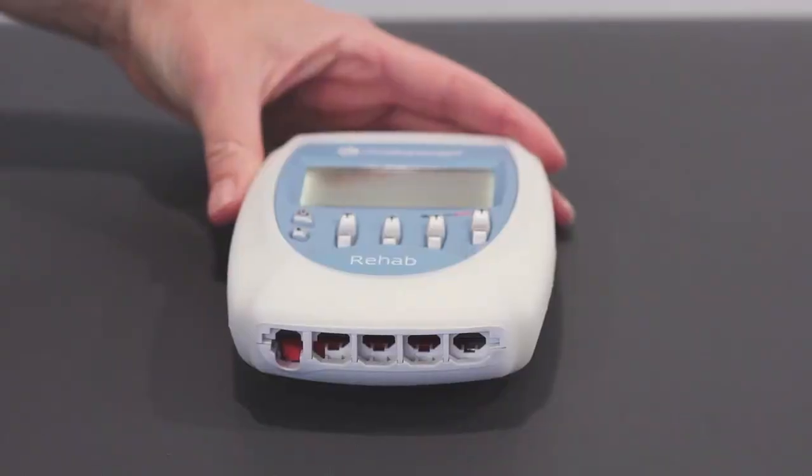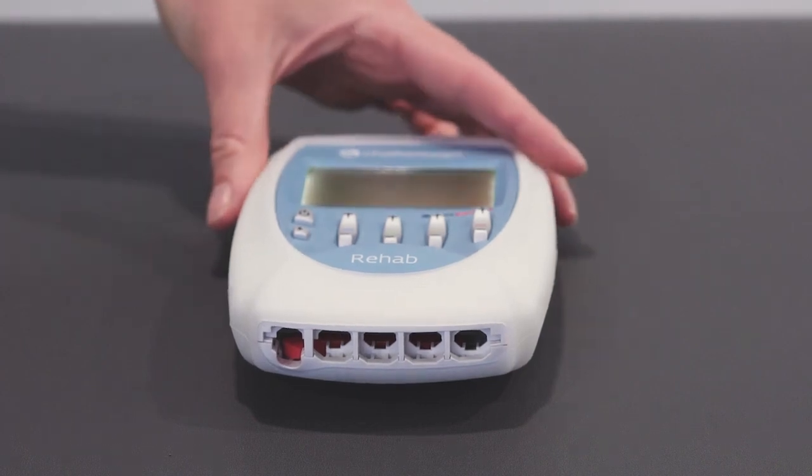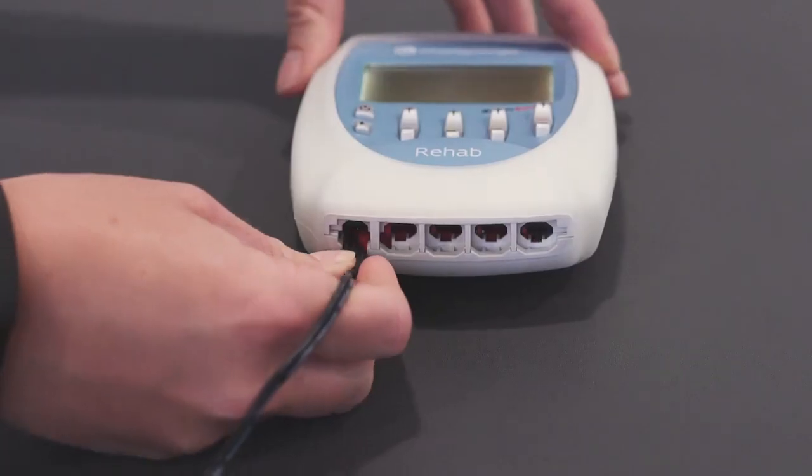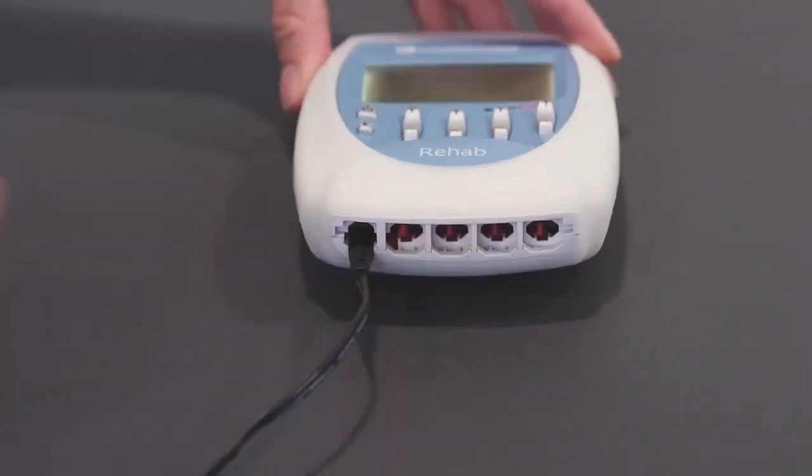When charging your Chattanooga Rehab unit, please make sure that no electrode cables are attached to the handset whilst charging. Place the adapter end in the far left port of the handset and make sure that you hear an audible click to confirm that it's attached.